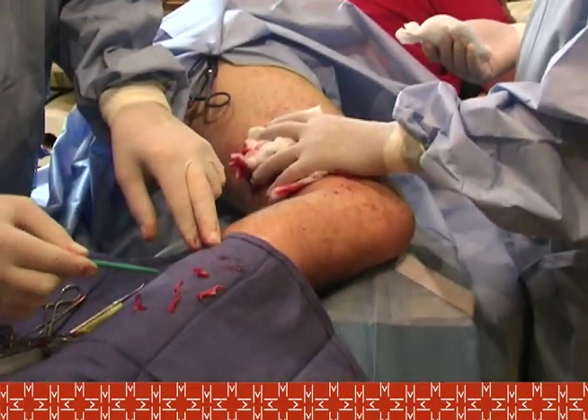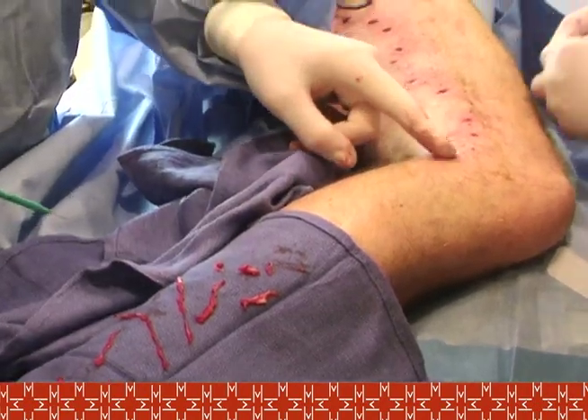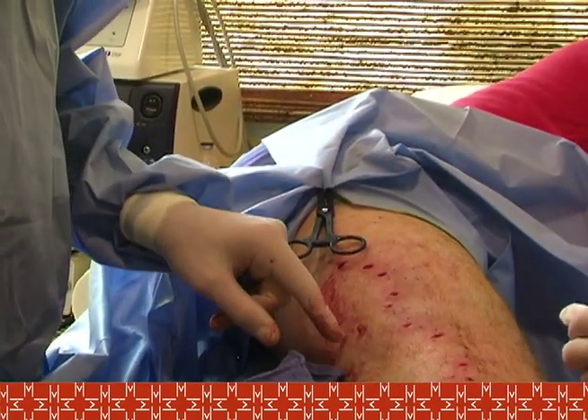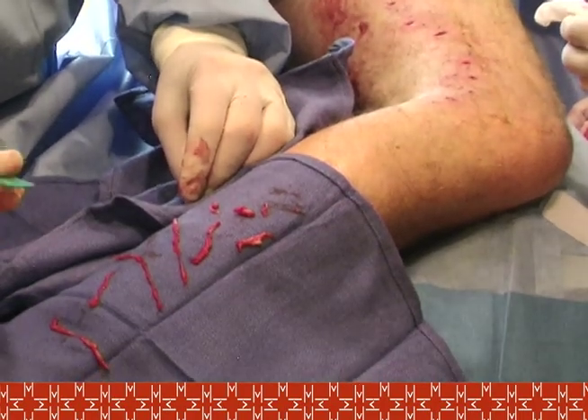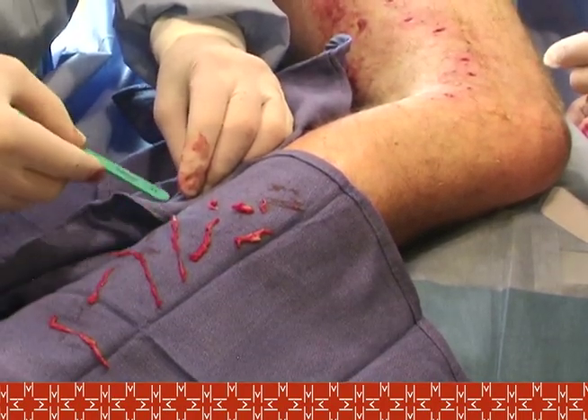My preference is to isolate multiple segments before performing phlebectomy — removing the vein. Here are segments of vein. As you can see, we've worked across 11 sites total. And this is the vein that we've extracted. You can see that by my scale it measures between five and 12 centimeters in length.